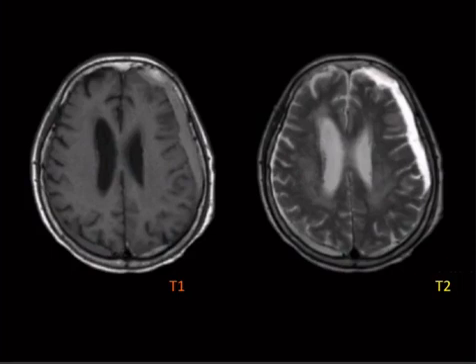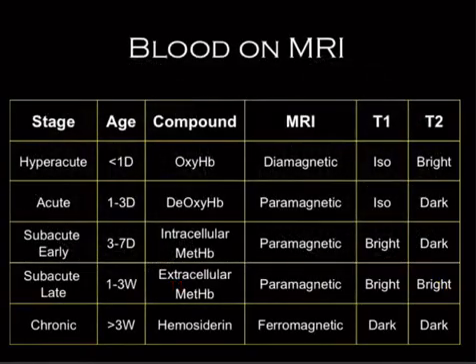So the paper this is based on has a pretty small sample size, so this doesn't always hold up in real life. This blood age dating was described only in CNS situations, and people who try to transfer this knowledge into the abdomen and the legs and arms don't always find it holds up, for a variety of reasons. Obviously it's complex. So this is the graph you'll see in books. It's very complicated. People will say just memorize it.